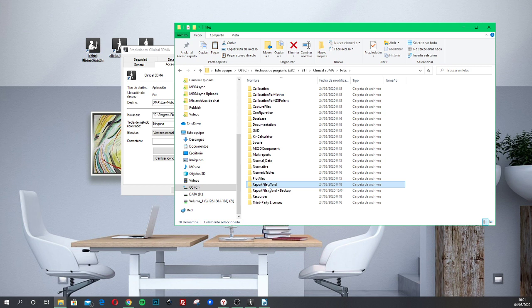Okay, inside this folder there are all the templates for the system. That's why I did a copy of this folder and I relabel it as backup. Why? Because in case I touch or in case I broke something in the system, I don't need to reinstall the system totally.